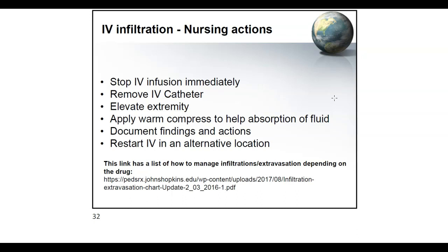And then document the findings and actions. Make sure you report it to your provider. It's not an emergency, but especially if a patient is heart sick, you may want to report that. But also if there are drugs infusing, you may want to report that too, so that you can get the appropriate orders if it needs a reversal agent or something like that.